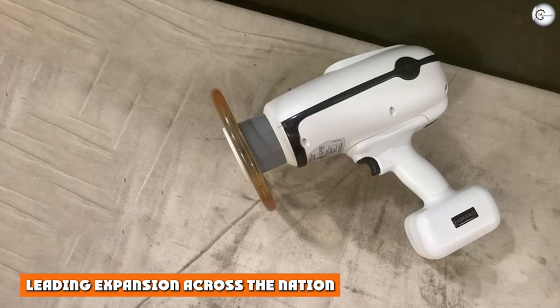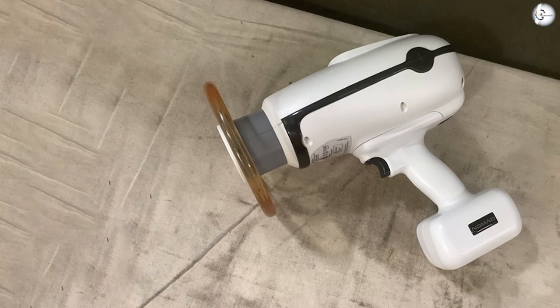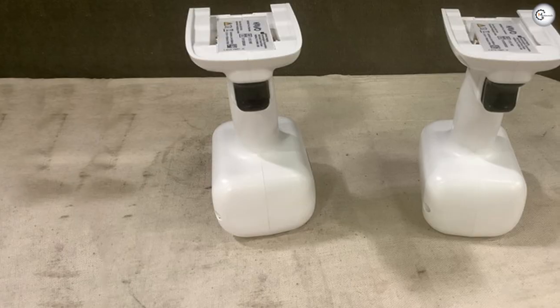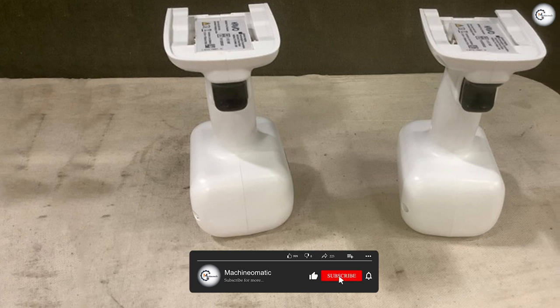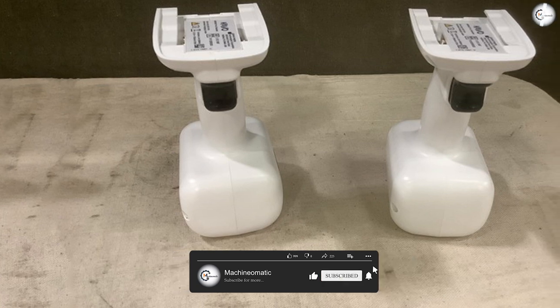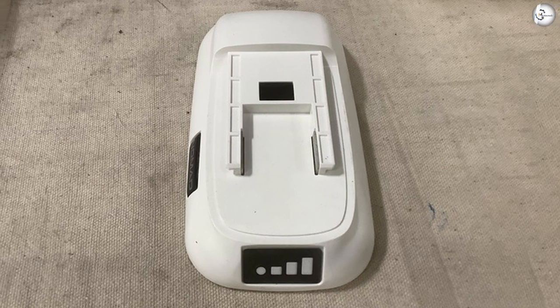Leading expansion across the nation, proudly manufactured in the U.S.A. The Nomad was the first handheld to the market and continues to be the world's leader in intraoral X-ray units. With our past successes and award-winning design, Nomad continues to be widely accepted in this rapidly growing area in dental technology.